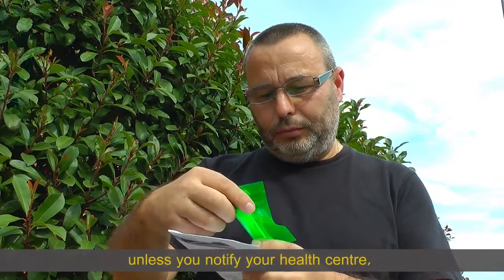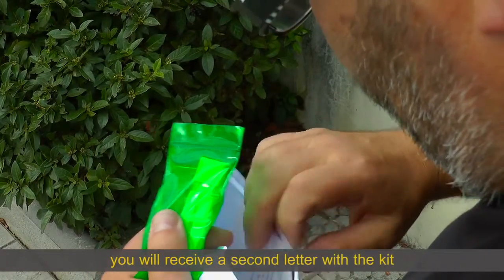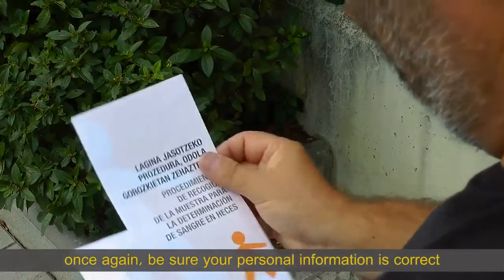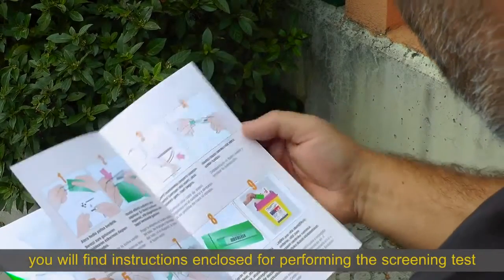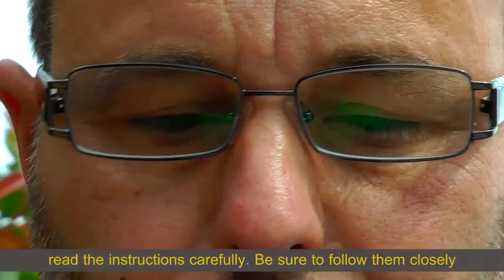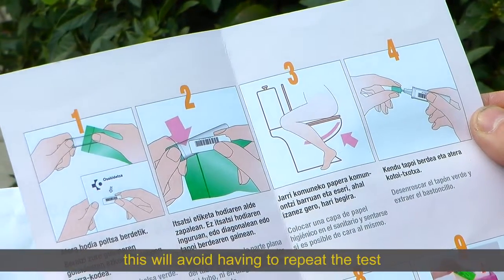Unless you notify your health centre, you will receive a second letter with the kit. Be sure your personal information is correct. You will find instructions enclosed for performing the screening test. Read the instructions carefully and be sure to follow them closely. This will avoid having to repeat the test.